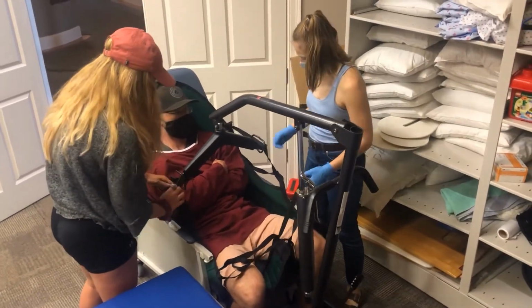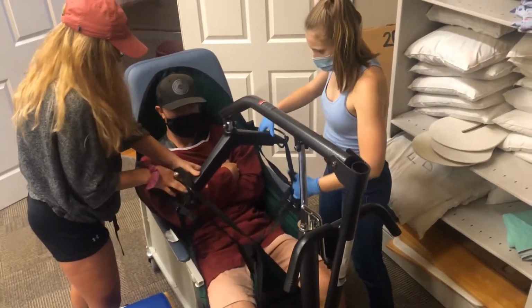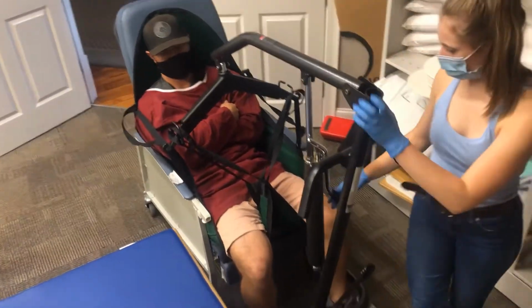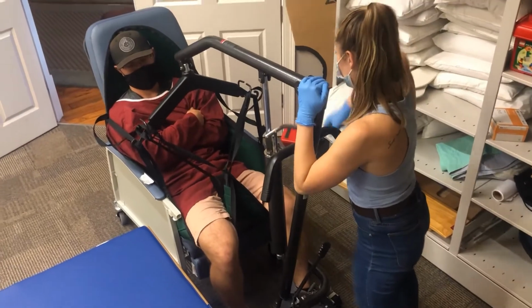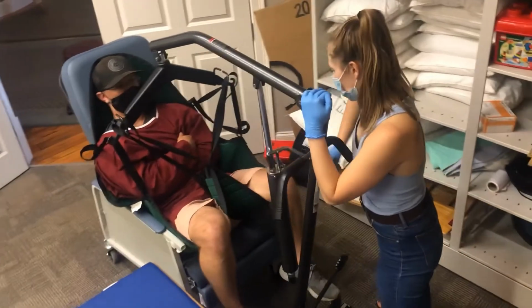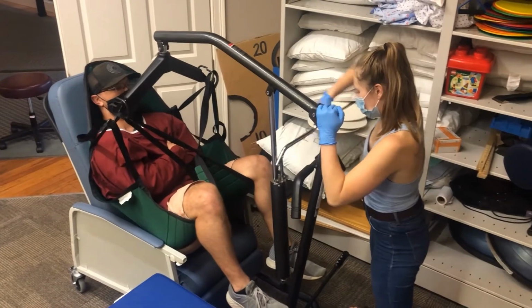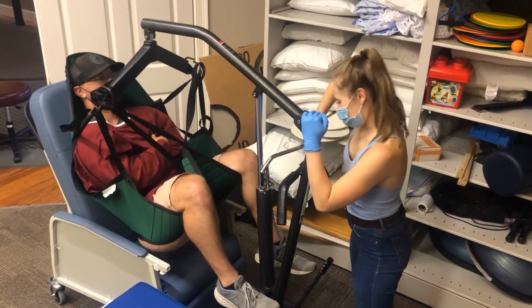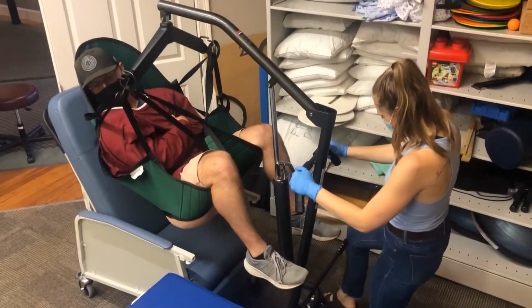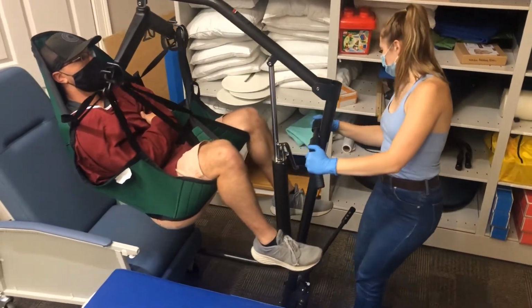Reloop the straps when you are ready to transfer your loved one back to bed. Make sure you loop the leg straps through each other as you did before. Ensure the metal handle is locked and begin lifting your loved one. Unlock the brakes and transport your loved one back to bed.